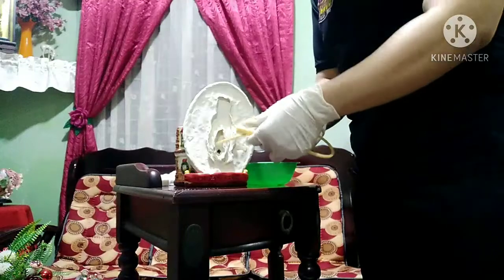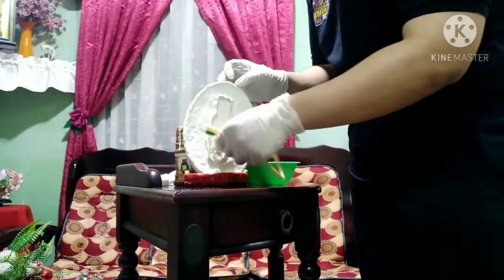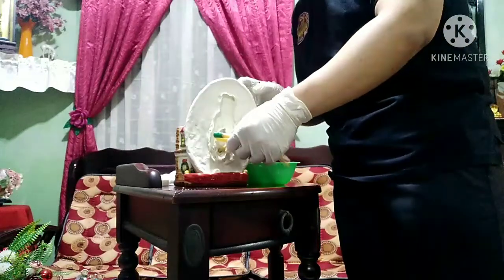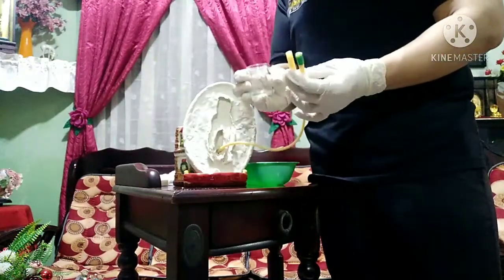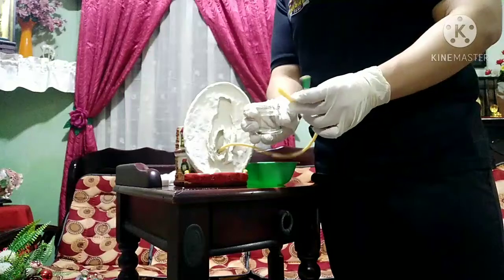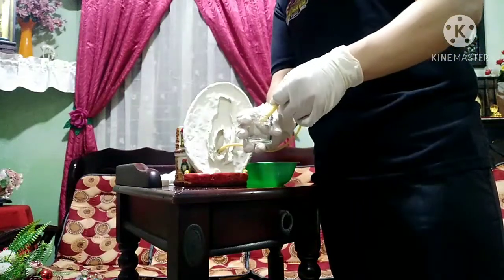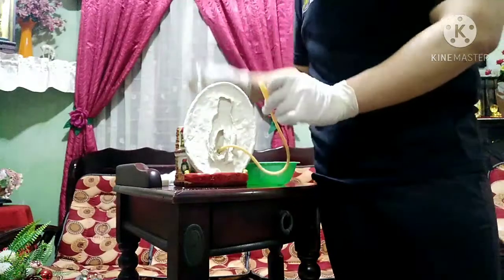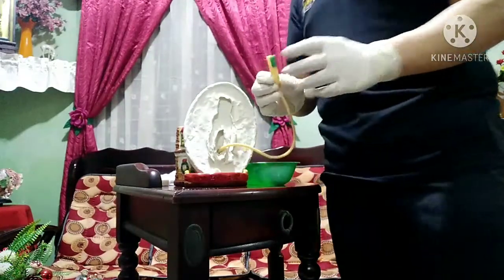Natanggal. Sorry po, medyo maluwag. So, ito po. So, mag-obtain po tayo ng specimen po. So, ayan po. Isalid po natin. So, kunwari po, meron na siya dito. So, ito po yung specimen. So, ayan.